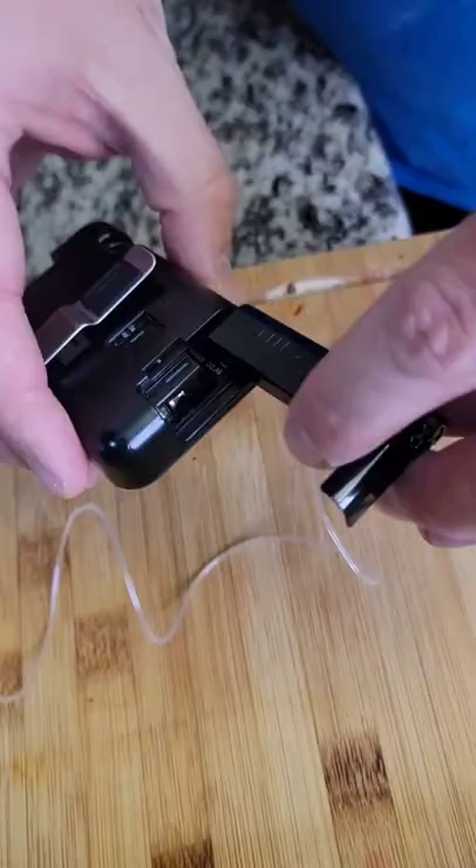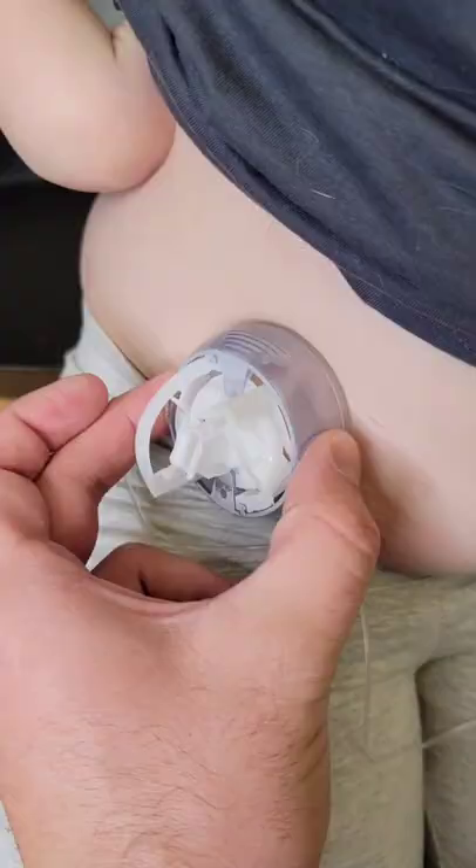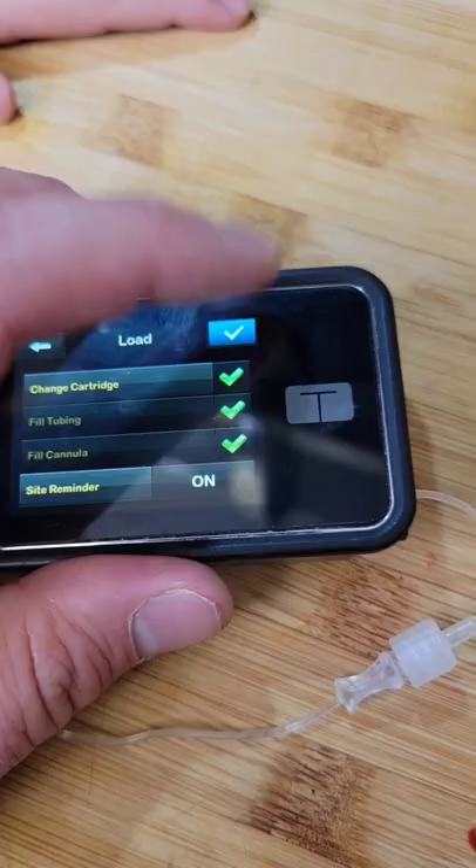Pop it and lock it, like so. Now for the scary part — inject it with the needle. We remove the needle, but it leaves the site in there. Fill up the tube and the cannula, and we're good to go.